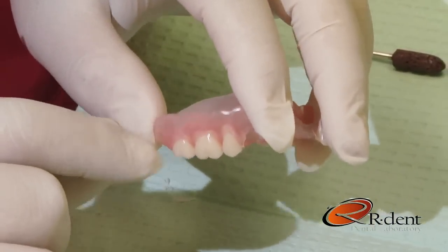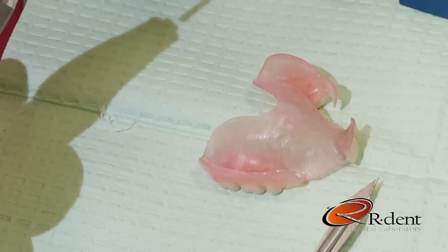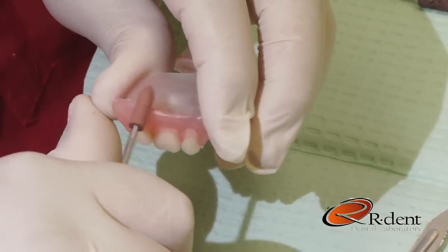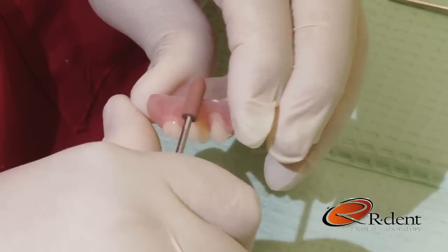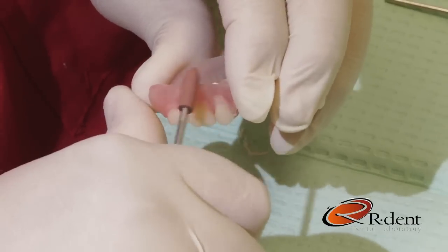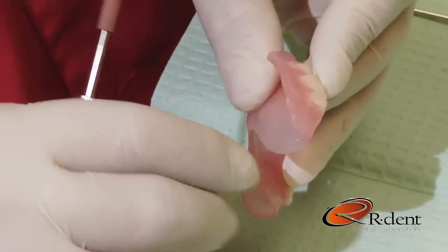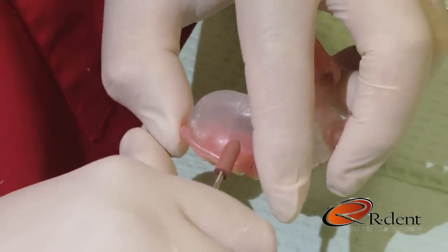Once you have the periphery surface smooth, we then begin to complete the polish with the brown silicone polisher. At approximately 15 to 20,000 RPMs in a left to right motion, I'm making constant contact with the periphery surface of the partial with the polisher. And as you can see, it really brings the partial back to its original shine.